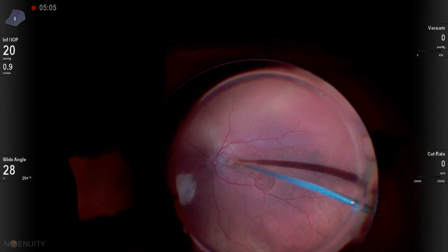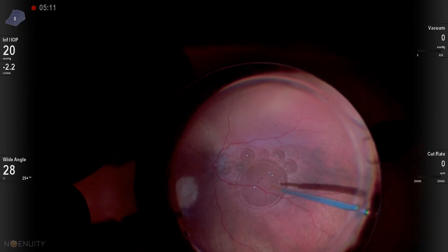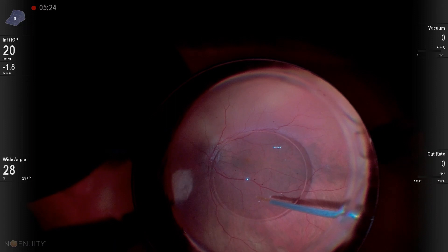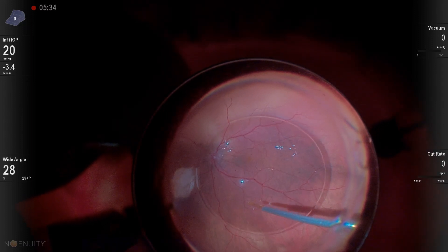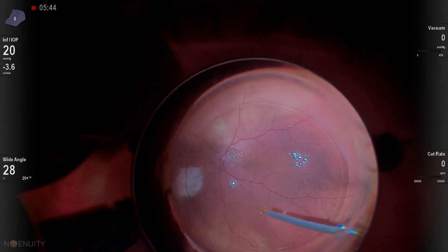I've sped some of these parts up. You can see at first I start to get multiple bubbles of PFO. That's not a problem if you don't have a big break or a giant retinal tear. This patient had small breaks, so I wasn't worried about those small bubbles going under the retina, and was able to unify them as I infused the bubble in.